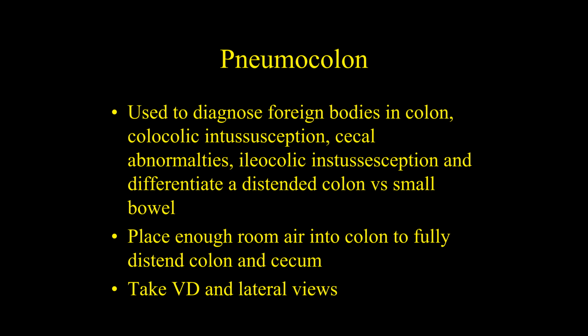You stick a catheter or tube, red rubber tube or whatever, into the dog's rectum, into the colon, and you blow the colon up with gas. With this particular one, again, I would not recommend using your mouth to blow into the tube. That can result in diarrhea in your mouth, and so I would probably refrain from that. But the best way is use a bunch of syringes and fill them up with gas, and you can inject those into the dog's rectum.